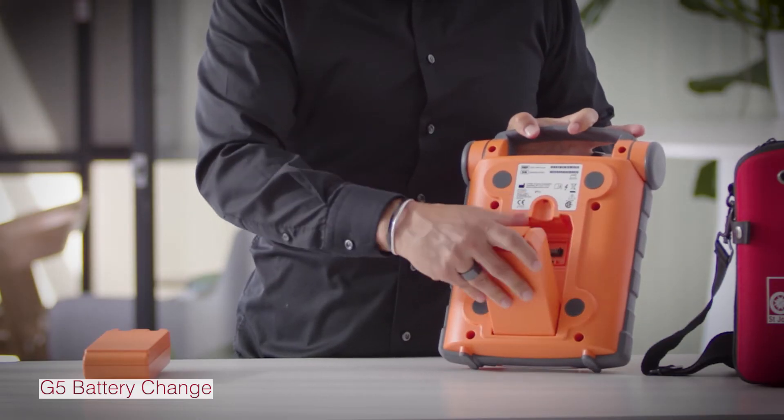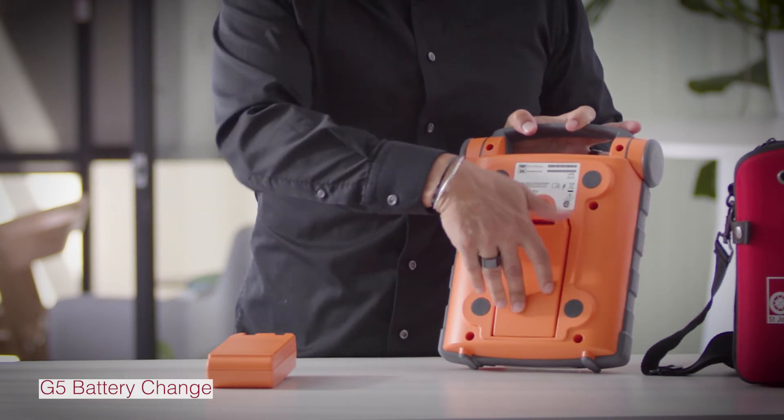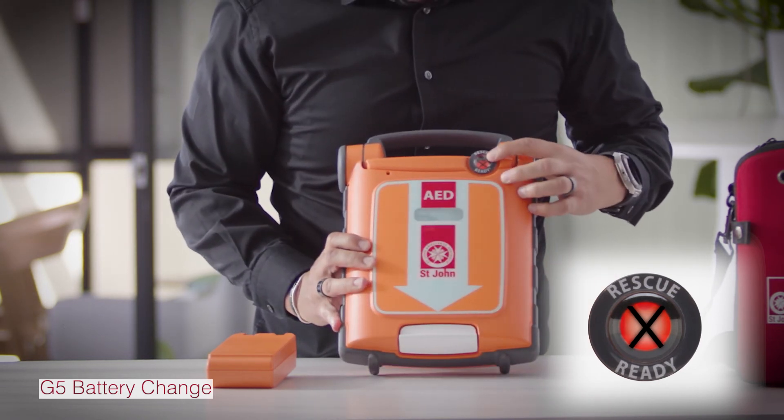Push on the latch to release the battery. The battery only goes in one way. When you hear the click, it's secure. To ensure that you've done it correctly, the rescue ready indicator will turn green.